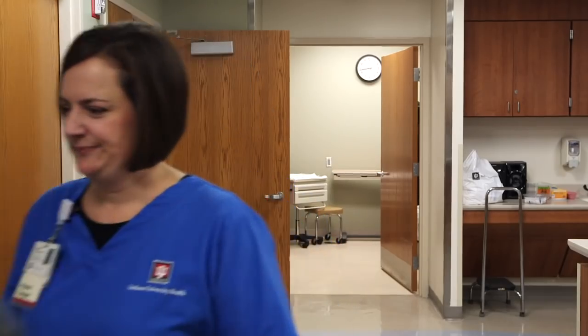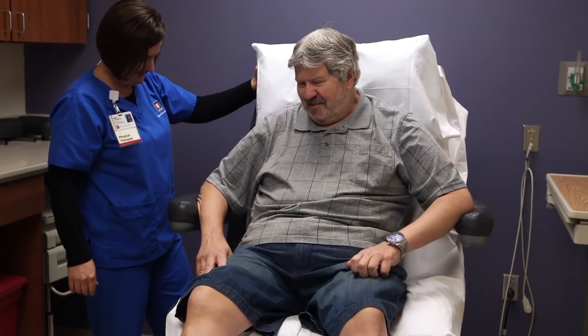It works. The custom total contact cast works. Our patients have healed beautifully. It's been a fun program to bring to IU Health.